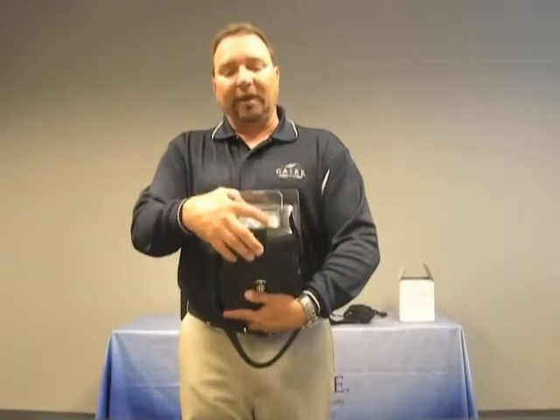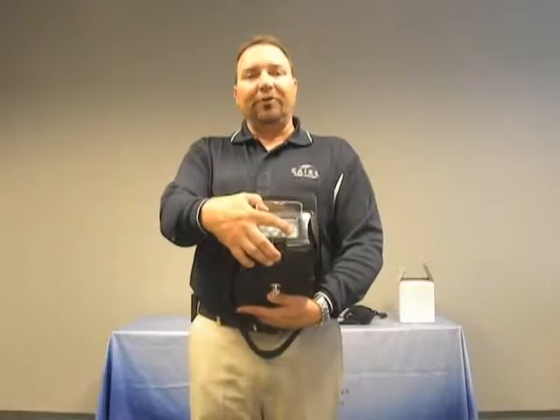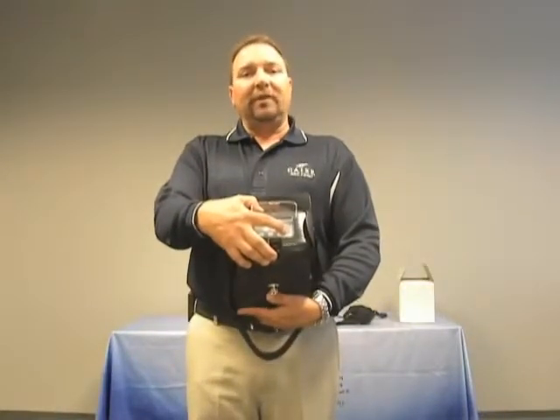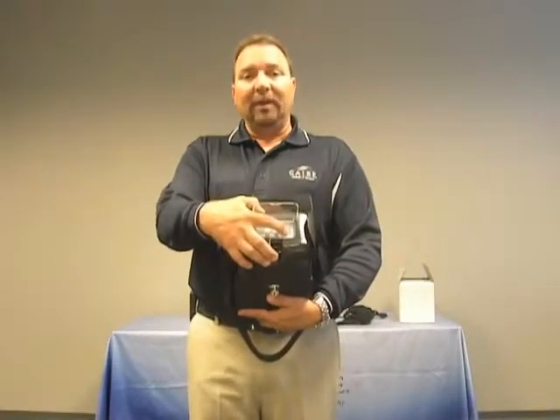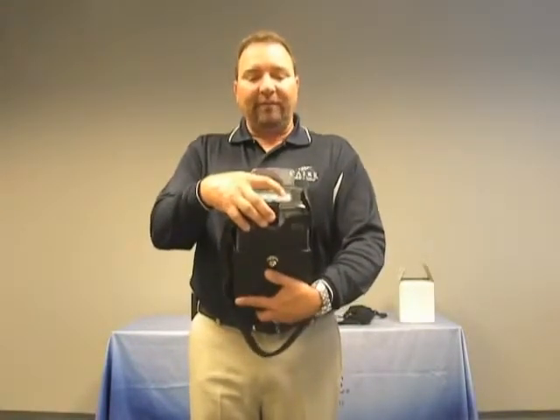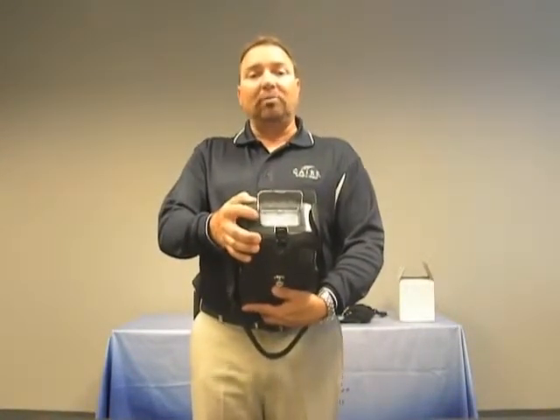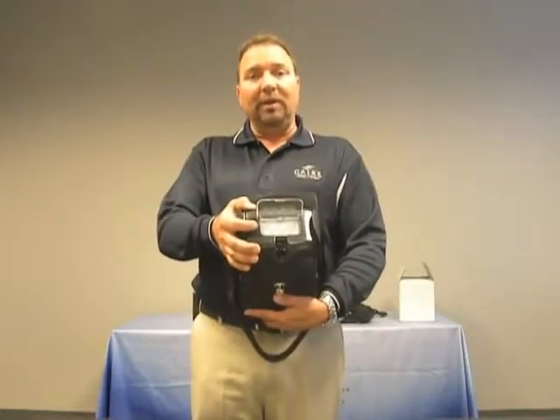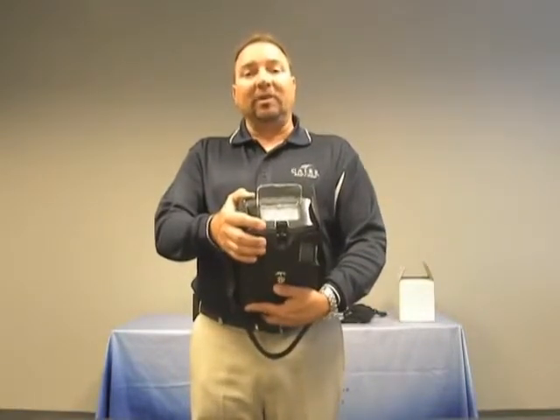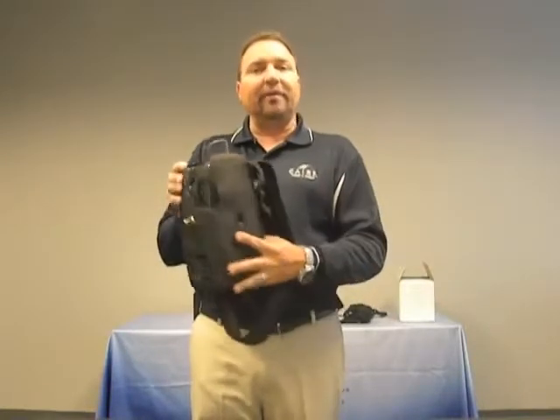If you look at the battery scale, you're going to see a series of LED lights, a total of 4, with the bottom LED being slightly larger than the other 3. The reason that it's slightly bigger is it illuminates either a yellow or green color. In the event that a patient would have a 25% light blink as well as an intermittent audible alarm, this is an indication that the internal battery of the FreeStyle 5 is getting low. This is also the point in time when the patient, if they were using an air belt, would want to plug the air belt into the side of the FreeStyle.